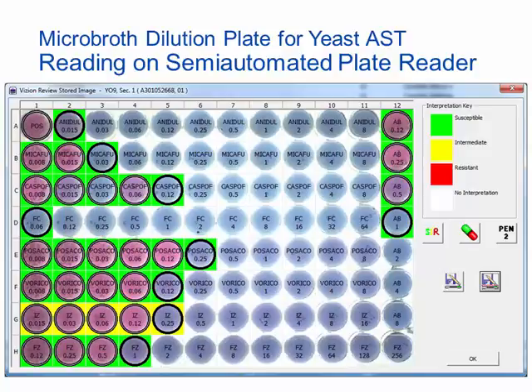What does this mean in practical terms? If we use micafungin and anidulafungin as an example, the micafungin MIC is read as 0.03 micrograms per milliliter. If we retested it a second time, the MIC result for the second test might be 0.015, 0.03, or 0.06 micrograms per milliliter, and these would essentially be the same result as obtained on the first test, since the inherent variability of the test is plus or minus 1 doubling dilution.